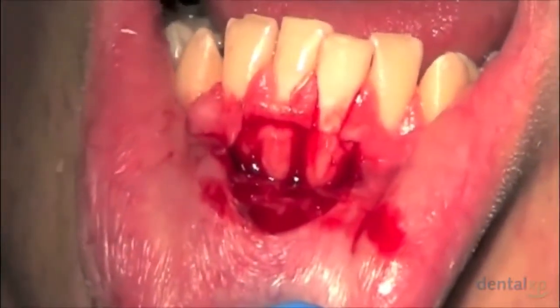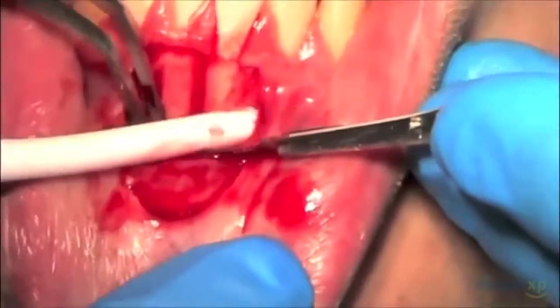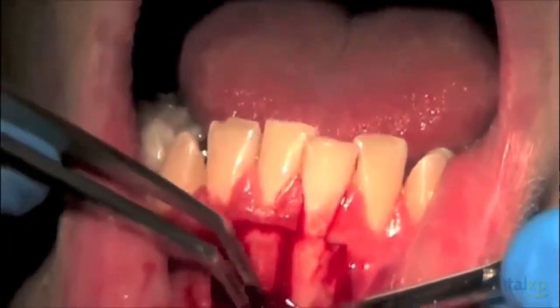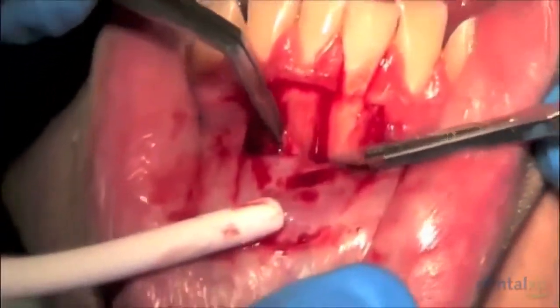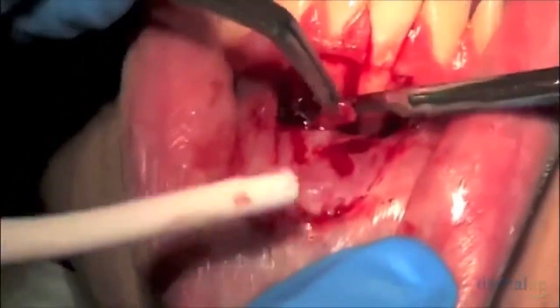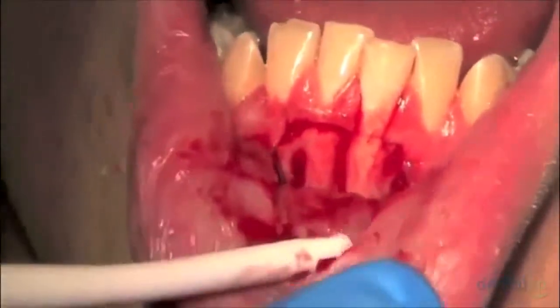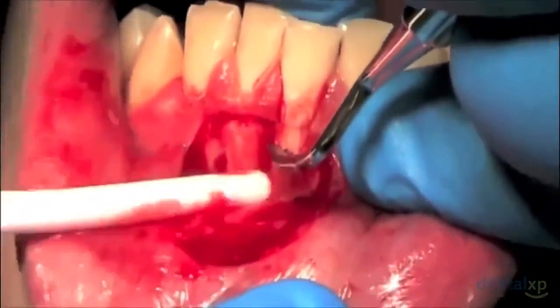In the next step of this procedure, basically what we're doing is using a number 15 blade to ensure that the recipient bed has been properly prepared. And by that I mean once the free gingival graft is placed, we want to make sure that the graft is stable and immobile, because any movement could cause the graft to fail.